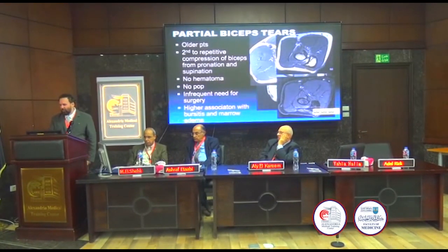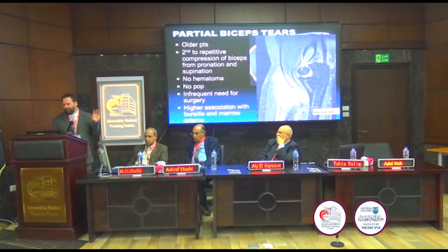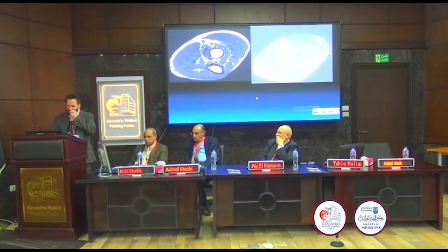So here's a partial biceps tear. Can you see the signal? Partially in the bicep tendon. Not surgical. Chronic. And association with bicipital radialis bursa. Partial biceps tear.